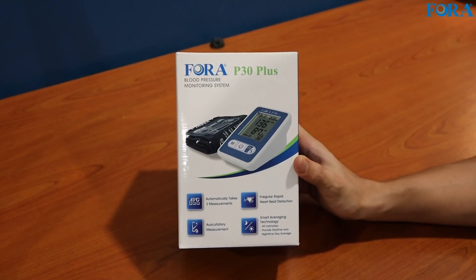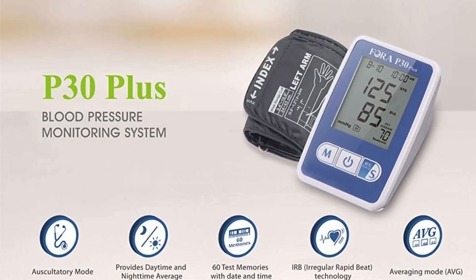Hey guys, I'm back with another unboxing and today I have the Fora P30 Plus. It's a blood pressure monitoring system.